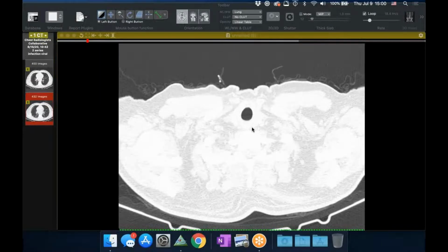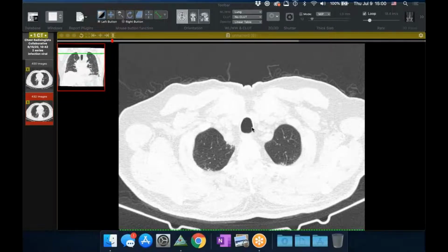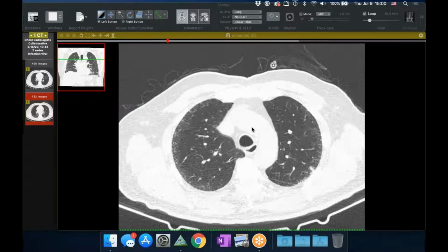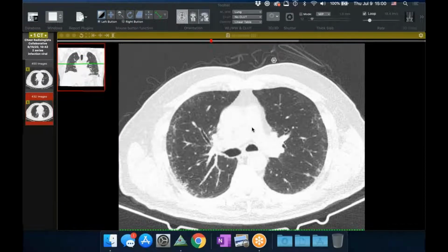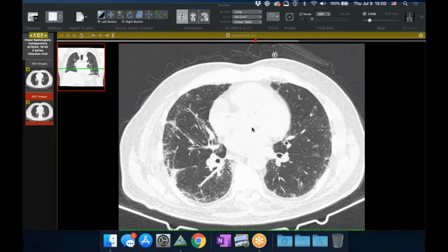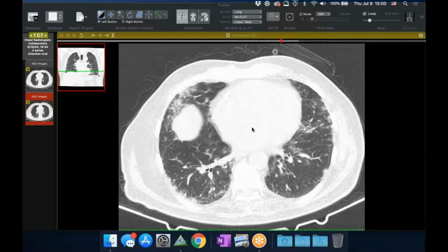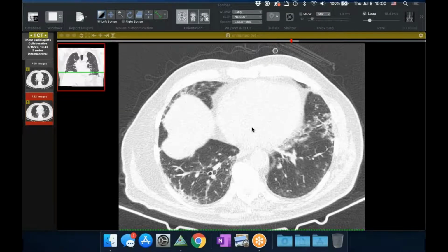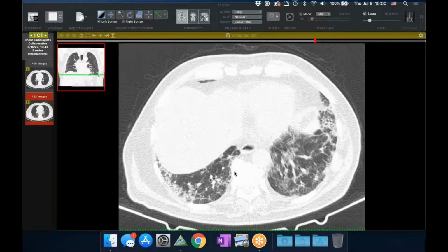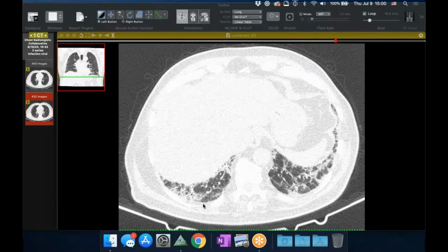Okay. So 72-year-old male who had COVID-19, and I hope I have the scans in the right order. So we see peripheral ground glass and sort of a reticular abnormality and sort of an organizing pneumonia type distribution, a little bit of some mild bronchial dilation at that time.